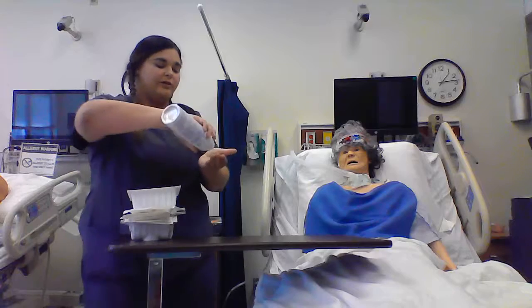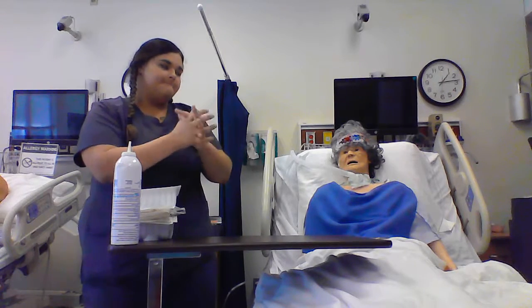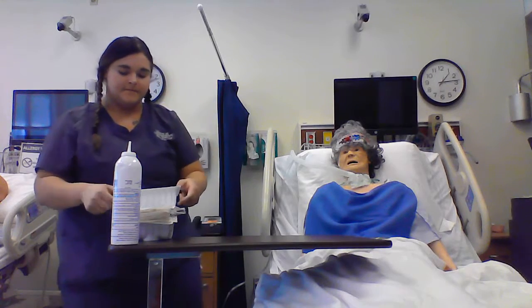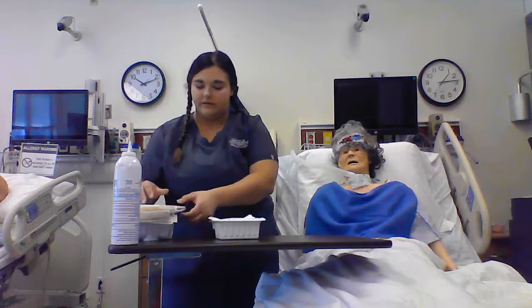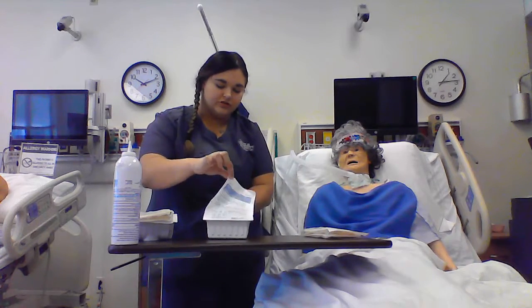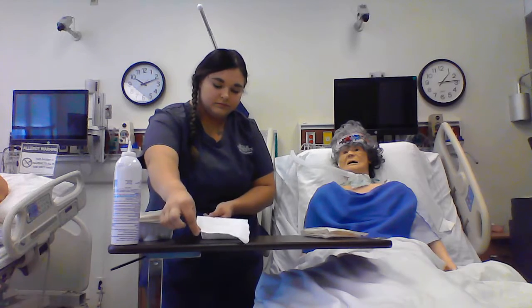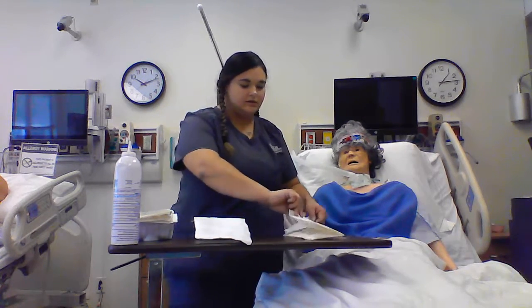I'm going to perform hand hygiene. I'm going to set up my field here. I'm going to open up my suction catheter tray. And then I'm going to open my sterile gloves.